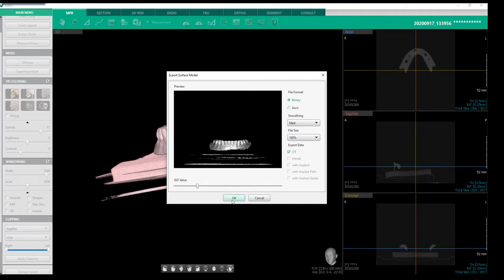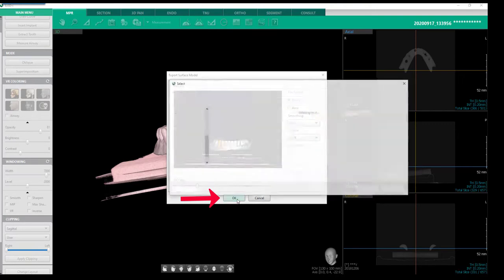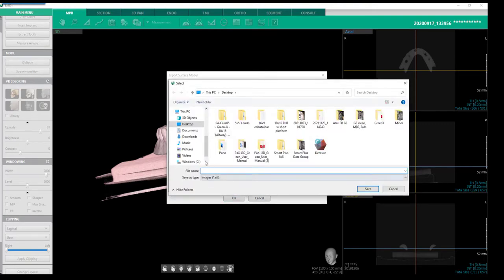The file format is defaulted to binary. If needed, file format, smoothing, and file size can be changed. Select OK to export to the desired folder. Provide a file name and click Save.